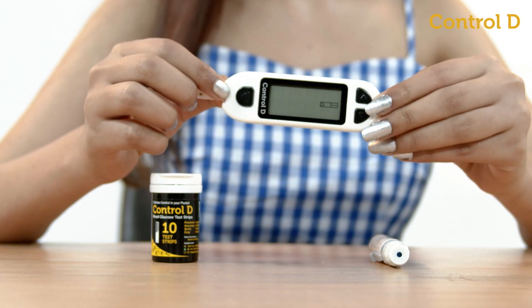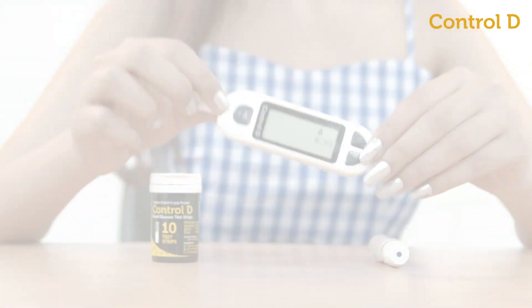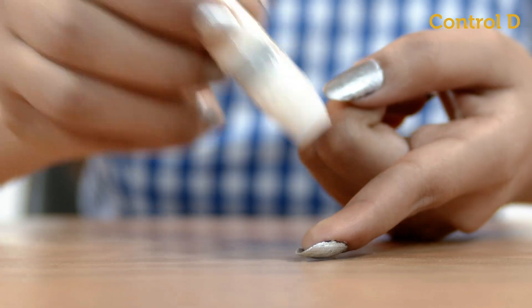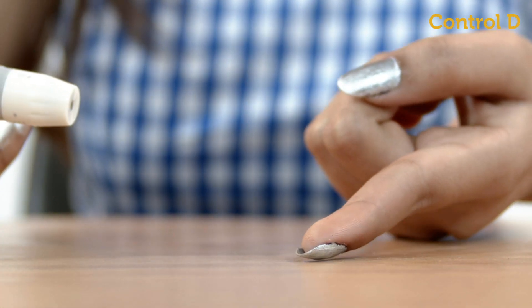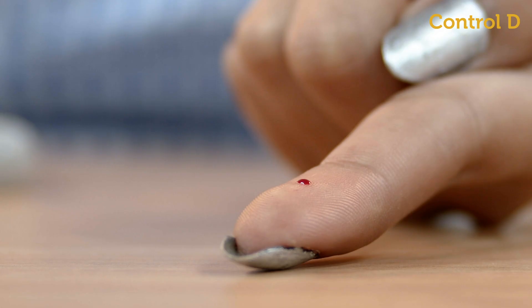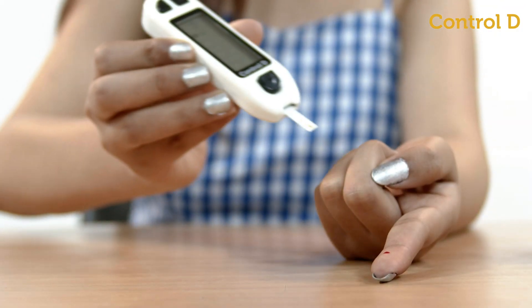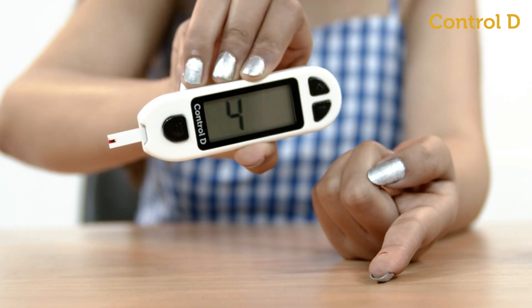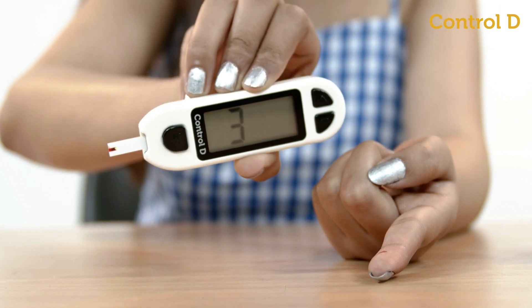The screen will display a blood drop sign. Press the lancing device firmly against your fingertip and push the button to prick. A blood drop will form at the puncture site. Touch the test strip gently against the blood drop — it will automatically absorb the blood and display the results in five seconds.